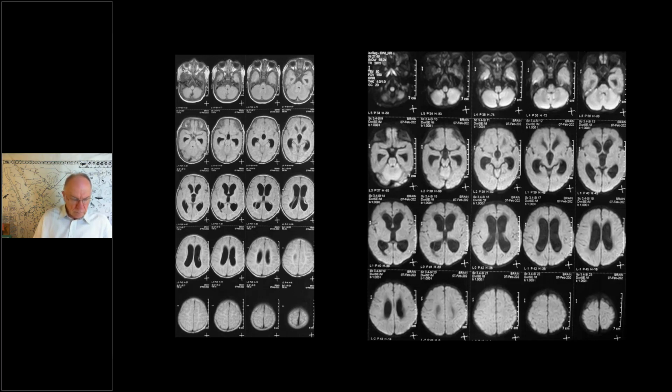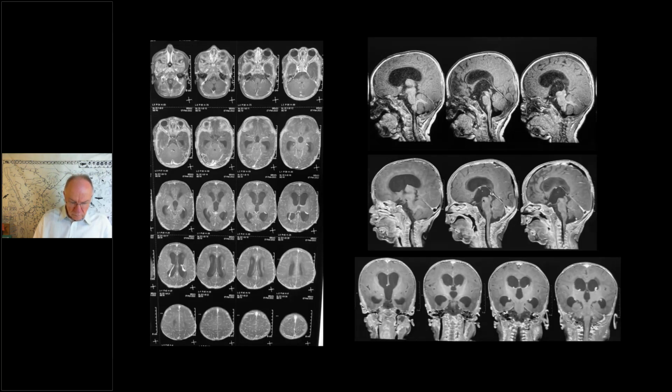Sugars are borderline. Mostly what happens is you have improperly treated or untreated meningitis, and then you have ventriculitis, which causes the hydrocephalus and aqueductal stenosis. So a ventricular tap will be important. Okay. Because I got the CSF abnormal, I didn't go for ventriculitis, even though I should say the ventricular margins are enhanced on this contrast. Nihaal, are the ventricular margins enhanced?